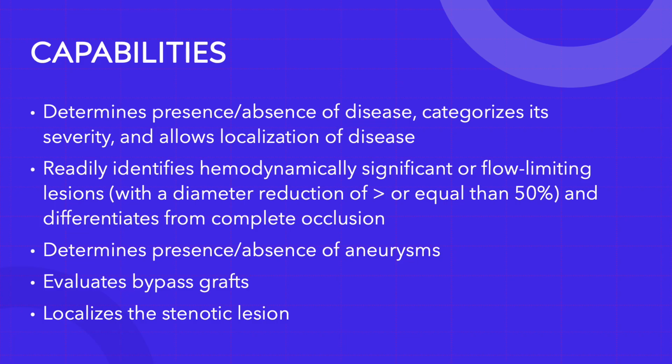So basically it's going to let us know if there is a significant stenosis. Is it greater than 50% or less than, or is it a complete occlusion? A complete occlusion means the entire artery is blocked, zero flow is going through.